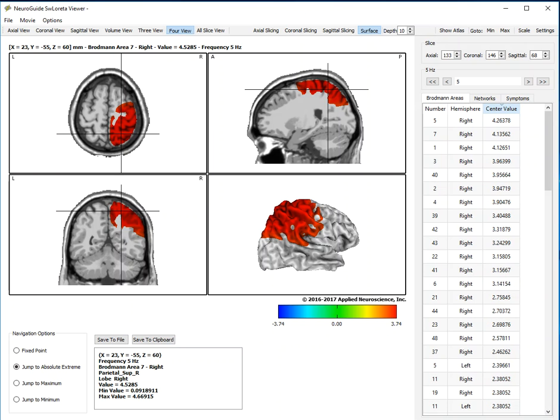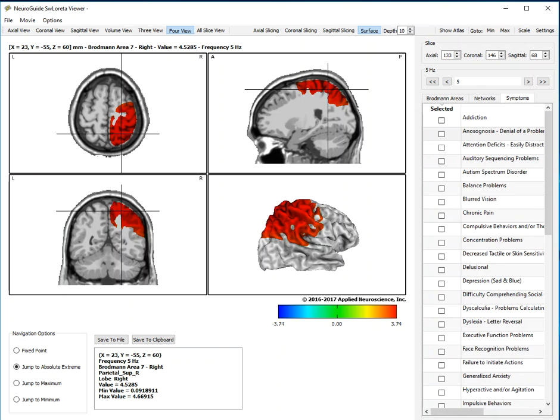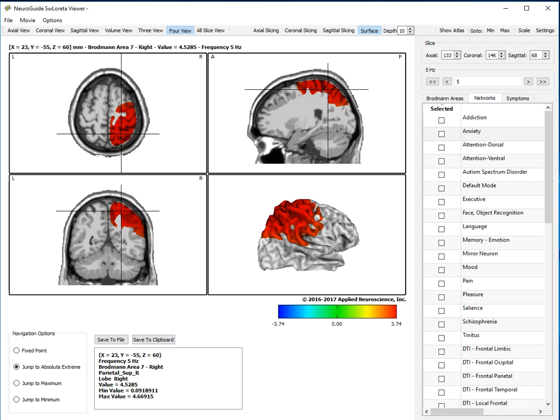But what's new is that we've now added networks and a symptom checklist. For example, with networks, one can select a network. Let's say we select the anxiety network.